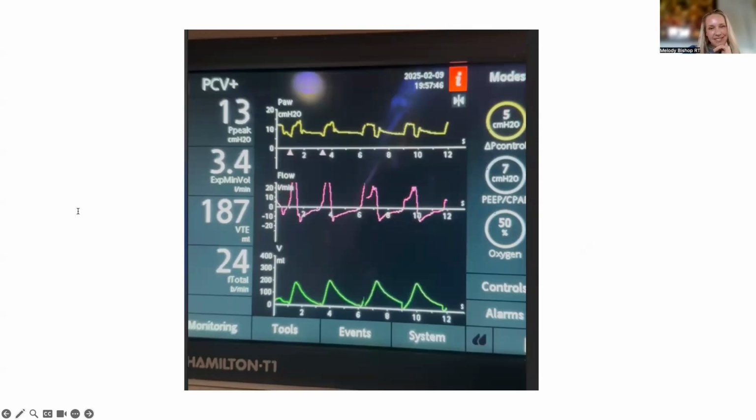I don't think it's amazing. I guess it's kind of small for my taste, to be honest with you. The screen is tiny. I would need to really have my glasses on to see it, but I don't use the T1 much. I never use the T1 because we have McKay's.